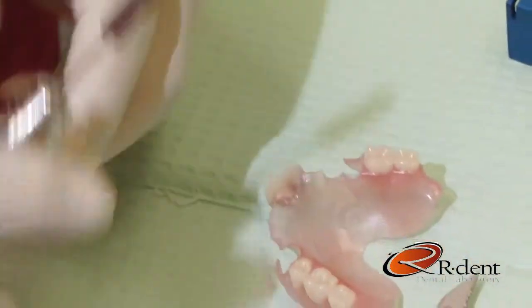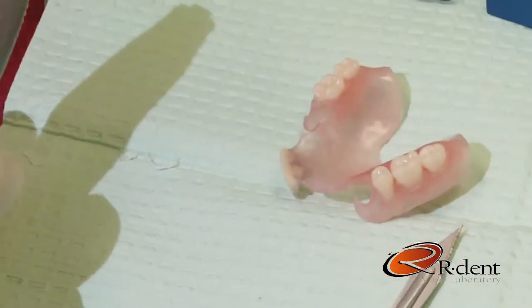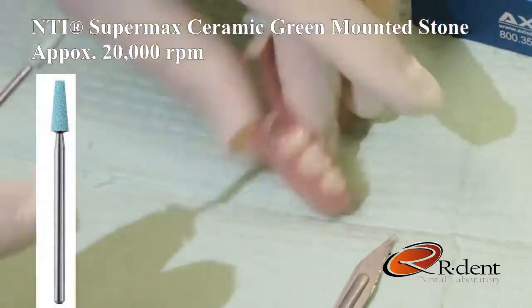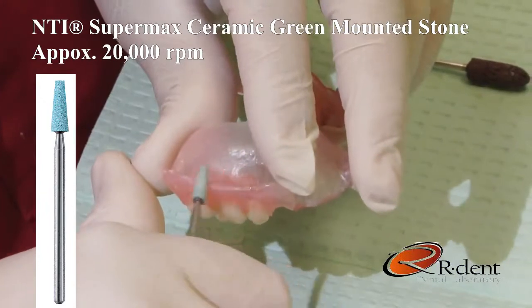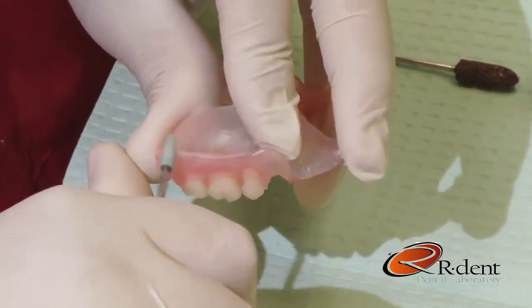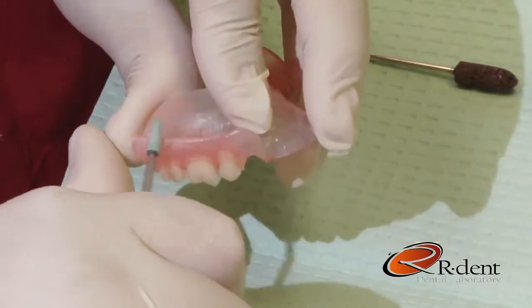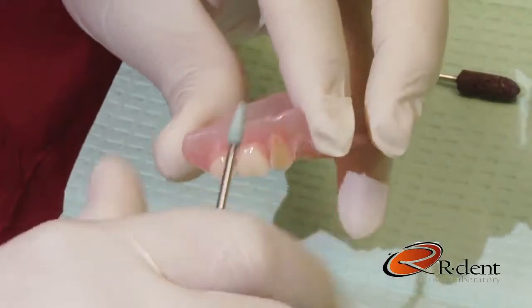Once all adjustments have been made and your periphery borders are at your desired length, we then begin to repolish the partial. First, by using the Supermax Ceramic Green Mounted Stone at approximately 20,000 RPMs, I place the stone on the periphery surface of the partial in a left-to-right motion and slowly begin to smooth the surface.